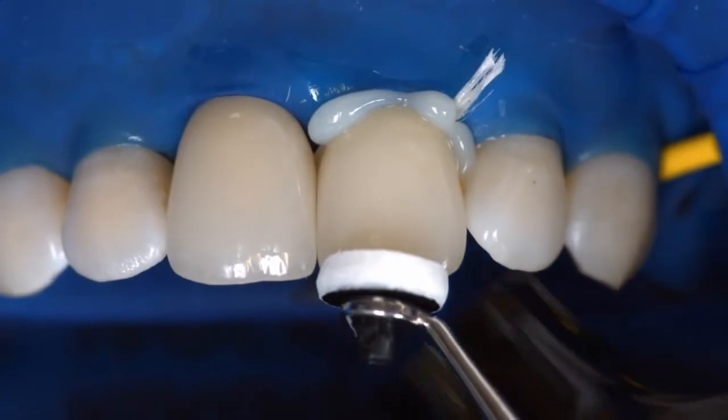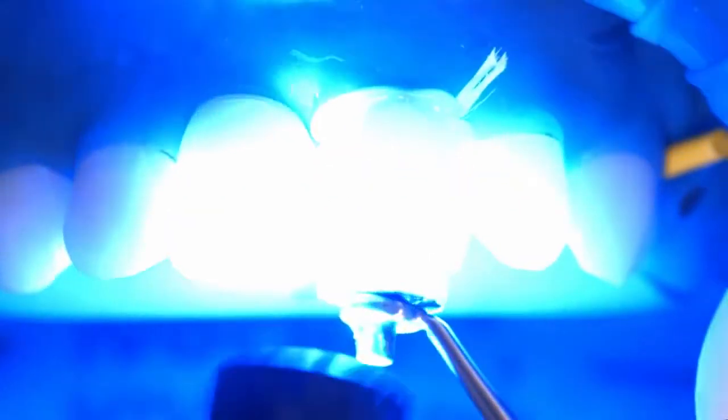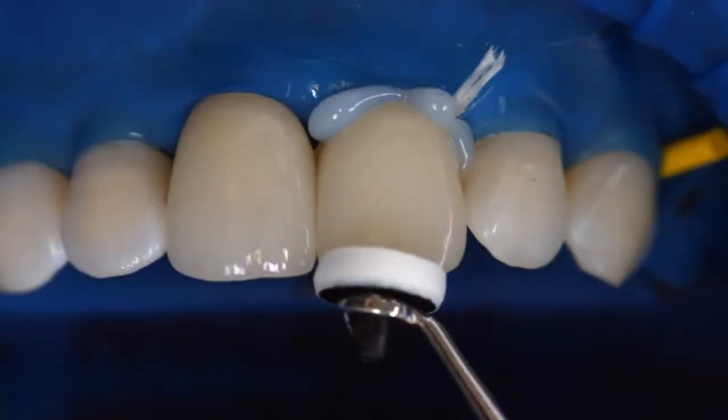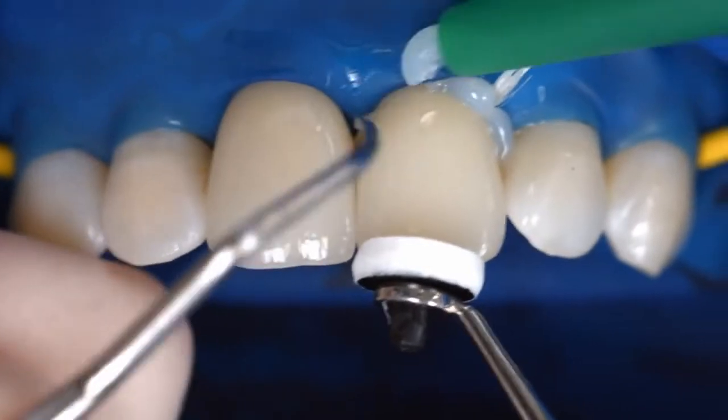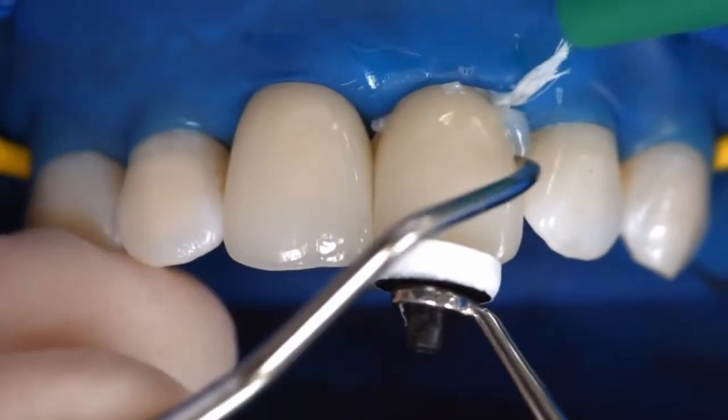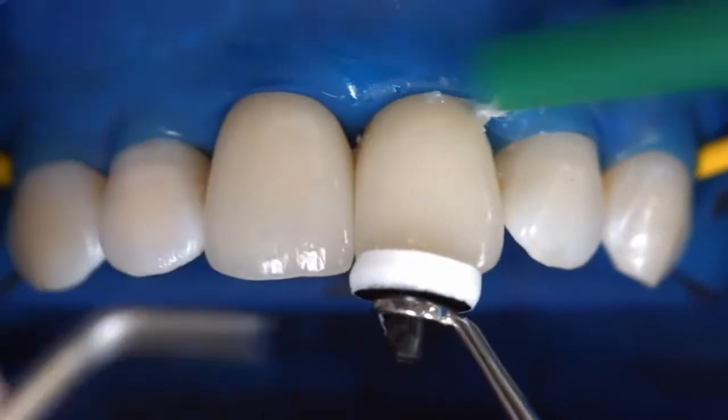Light cure cement excess using the Bluephase Style, for example. Start with the palatal surface and move the light guide in a circle along the entire cement line in the course of 2 seconds. Make sure that the distance between the light probe and the restoration is between 10 and 15 millimeters.